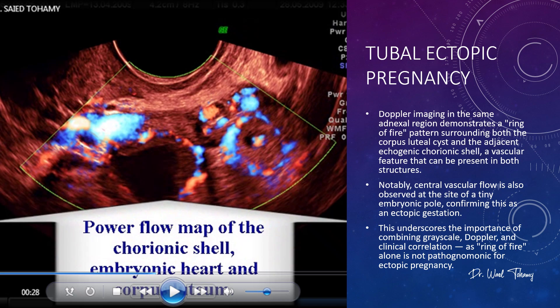Let's look at the Doppler image from the same adnexal region. Notice the ring of fire pattern — but here's the catch: it surrounds both the corpus luteal cyst and the adjacent echogenic chorionic shell. This vascular ring can appear in both structures, so it's not enough on its own to call an ectopic pregnancy. What clinches the diagnosis here is the central vascular flow right at the site of the tiny embryonic pole, confirming this is an ectopic gestation. Always combine greyscale, Doppler, and clinical correlation before making the final call.